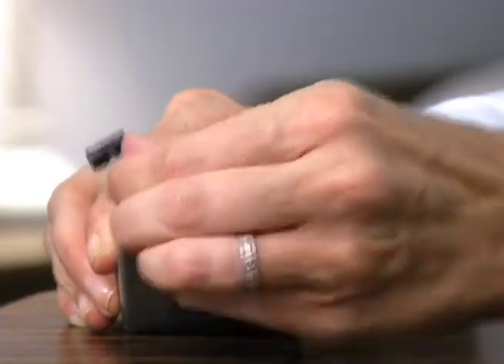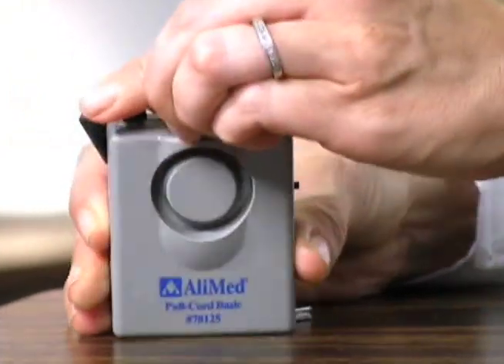To test, pull the pin from the alarm. The alarm will sound. Adjust to the desired volume.